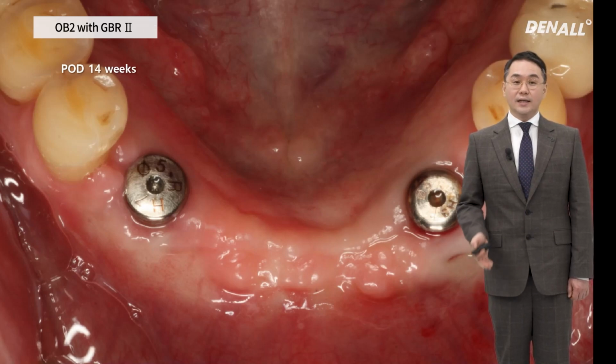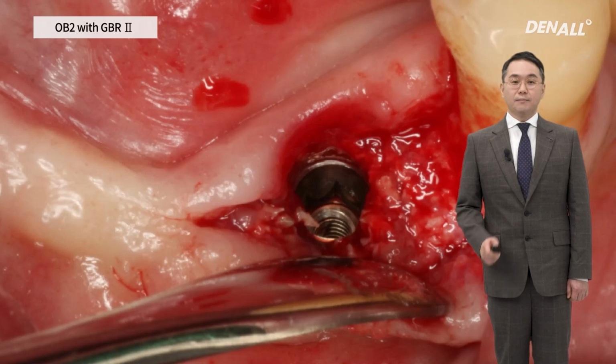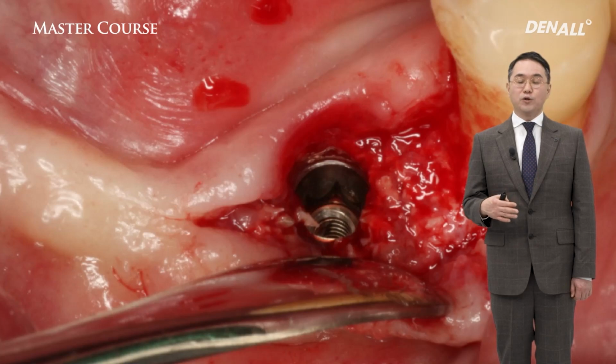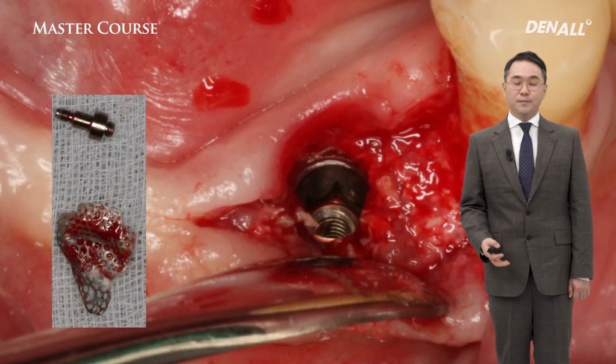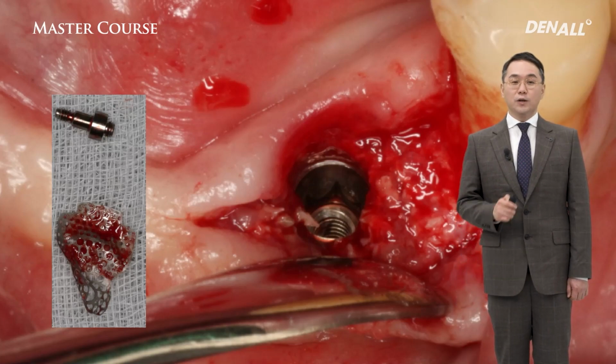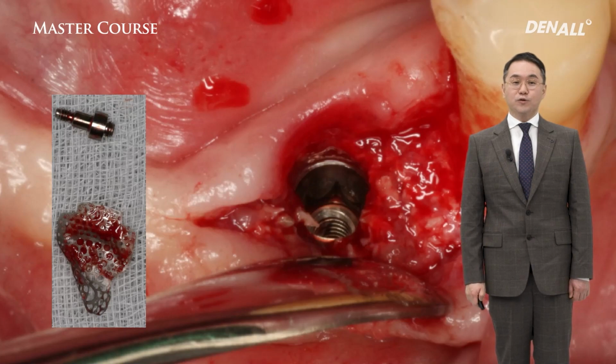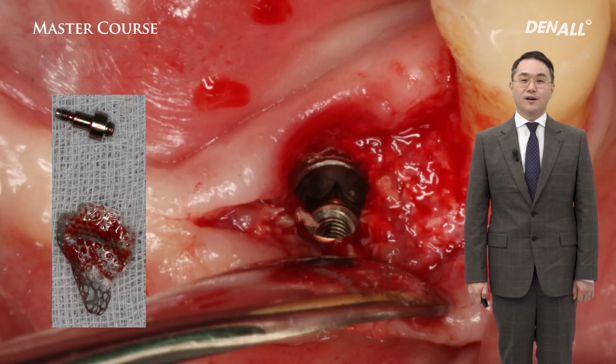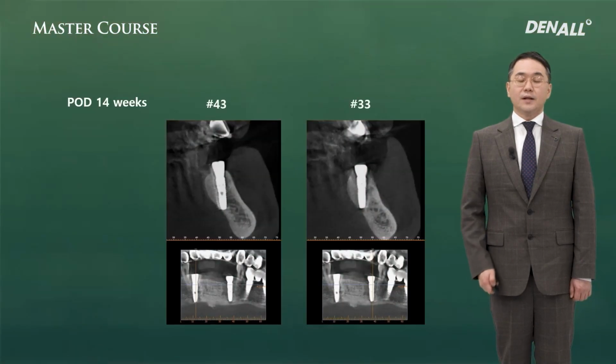I made a small incision on the crest. I removed the healing cap, and then I detached the flap towards the buccal side. I removed Ossbuilder and removed the anchor which was fixating the Ossbuilder as well, and used the conventional healing abutment and did suture. You don't need to open flap extensively.